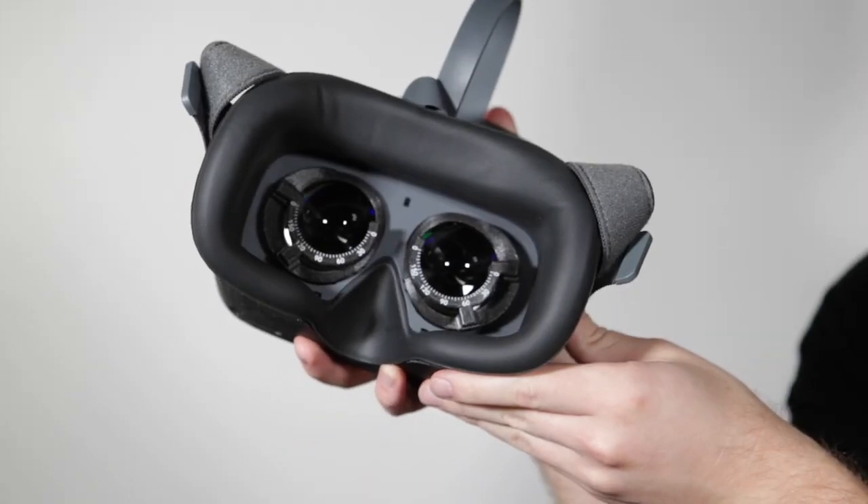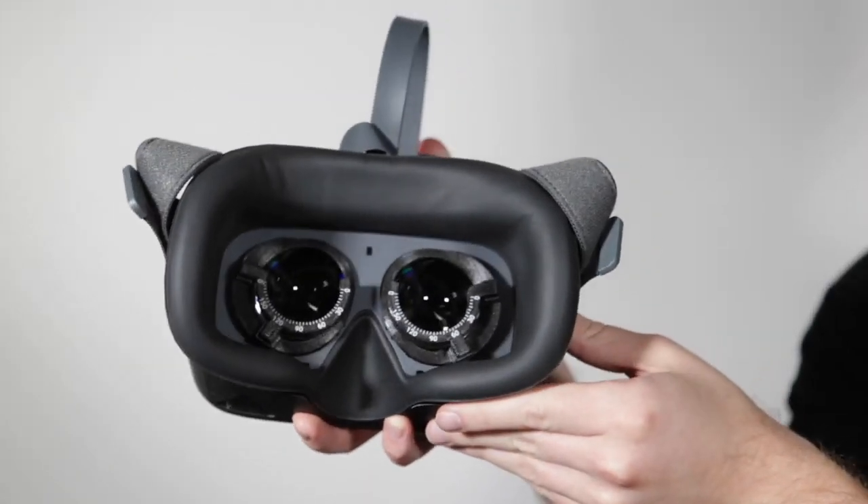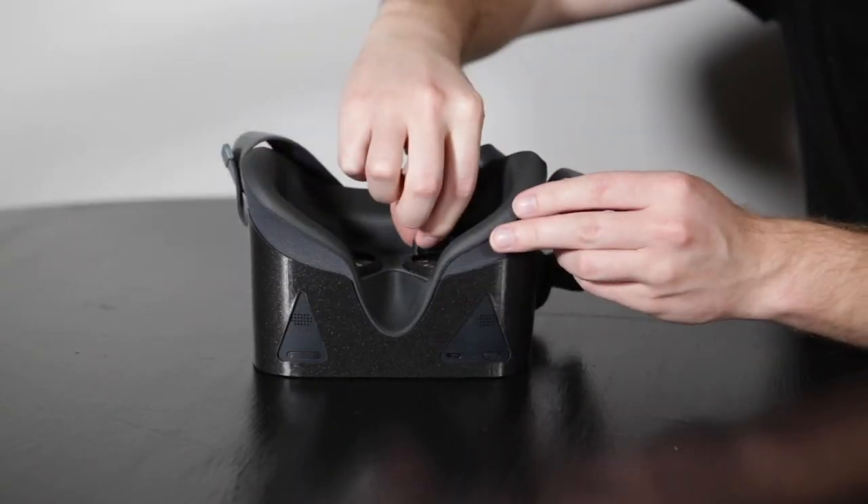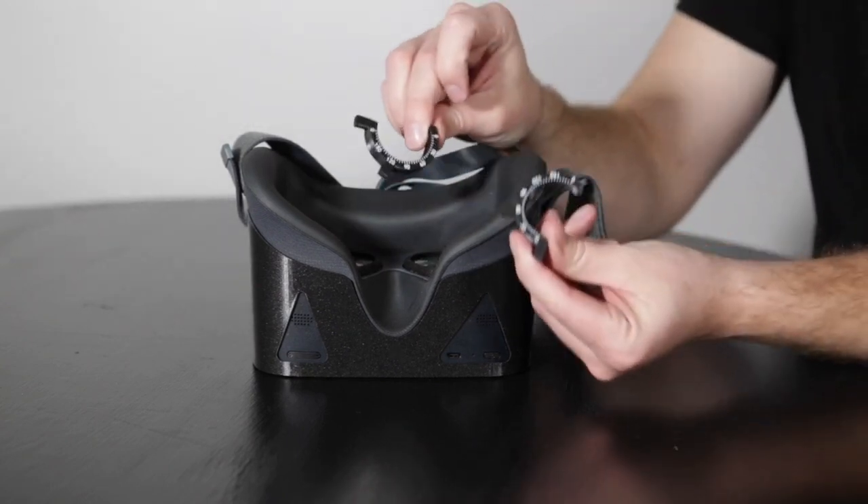Each virtual field headset comes with two removable trial lens adapters. Enter the patient's distance prescription into the trial lenses. You do not need to make any adjustments for near vision.